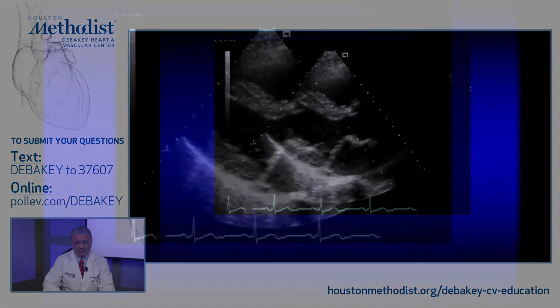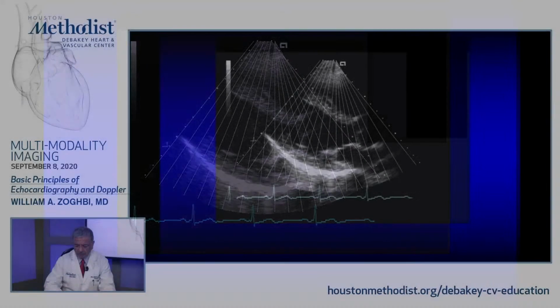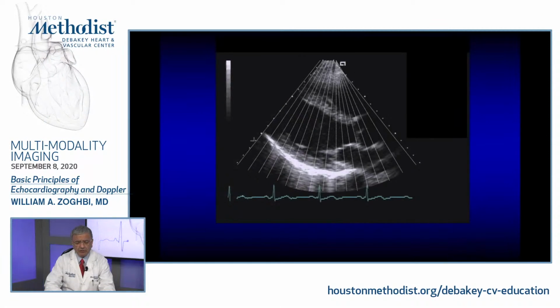And this is a 2D examination. The question is how do you make this image? And these are actually made by steering the beam from the ultrasound, using piezoelectric crystals that are deformed with electricity and send the ultrasound wave. So you can have so many scan lines along the line there with some interpolation. But notice also that because of the ribs the way they are, we have to image in between them.